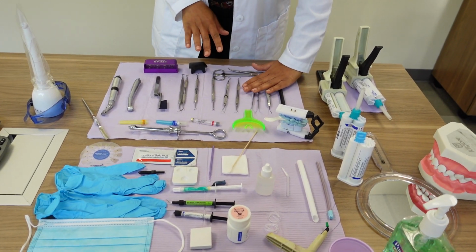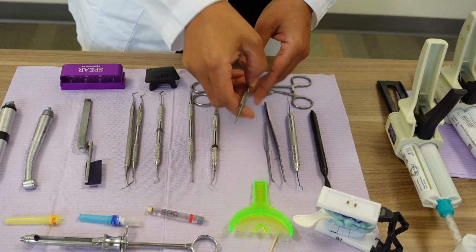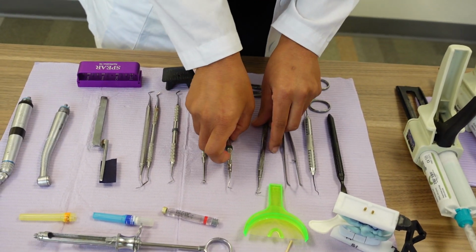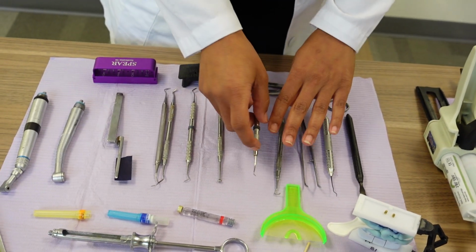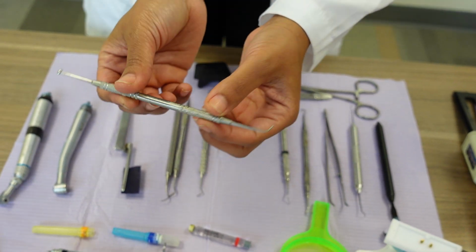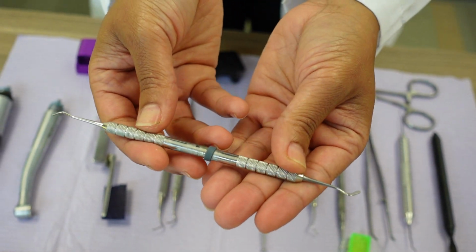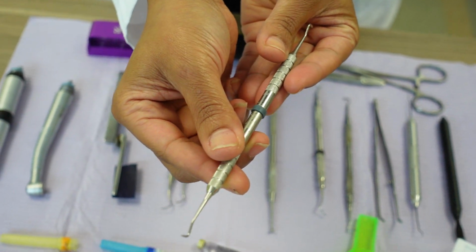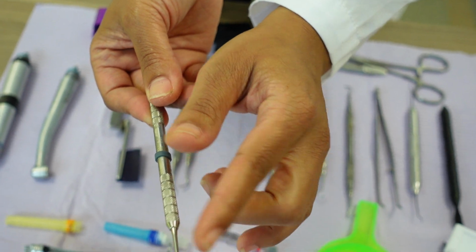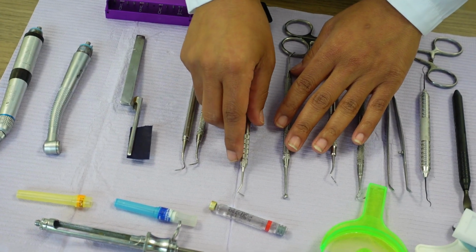So we have our basic setup, which is a mirror, explorer, and cotton pliers. We have our spoon excavator. We have our condenser. We have a football burnisher with both ends, small and large. We have a composite instrument, plastic instrument. They call them two different things, but it's used because we have a paddle on this side and the condensing part on that side, which is very convenient.